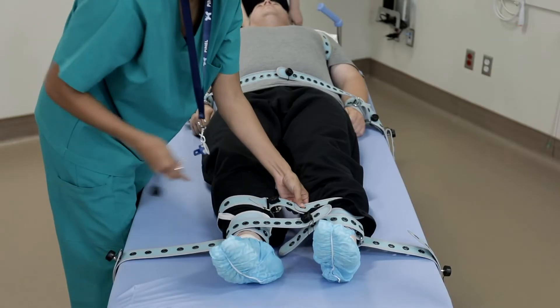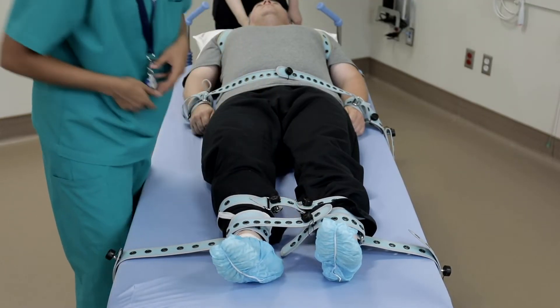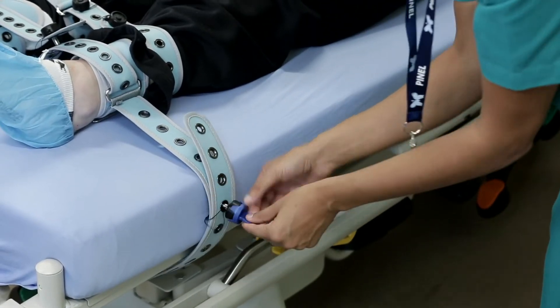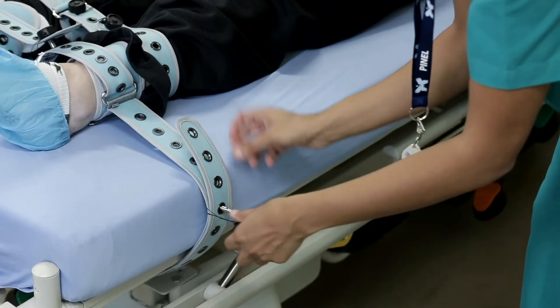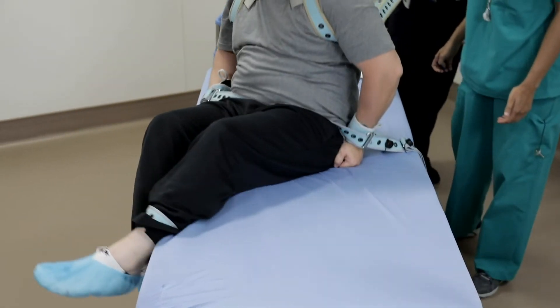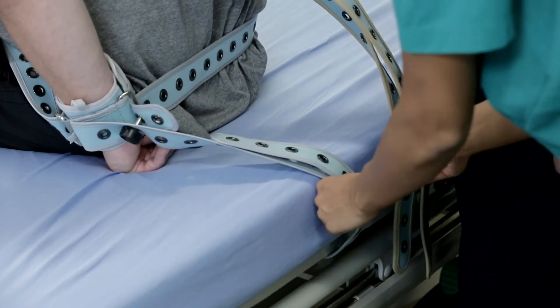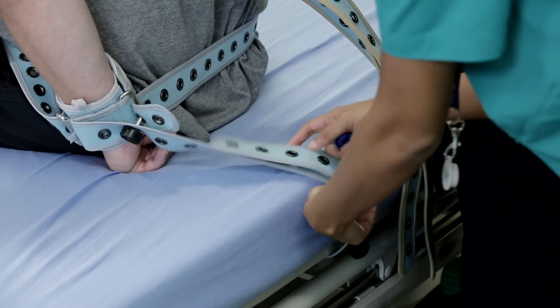For patients who are at risk of running or kicking, secure the legs with the short utility strap. The legs can now be detached from the bed frame. The patient then swings their legs to the side of the stretcher. Notice that the patient is still attached to the stretcher with one wrist. Finally, release this wrist and the patient is ready to walk.